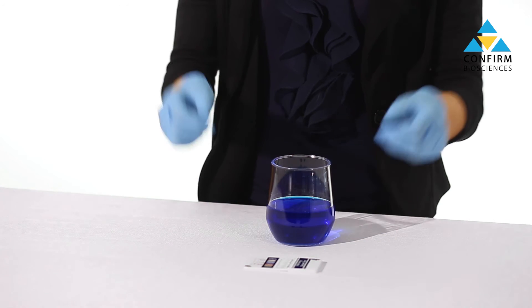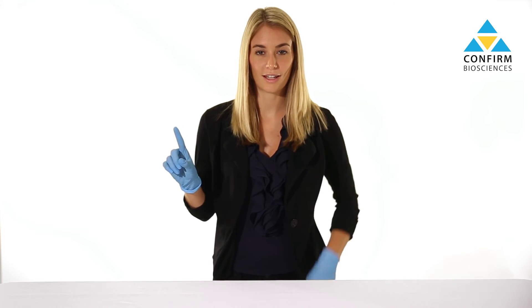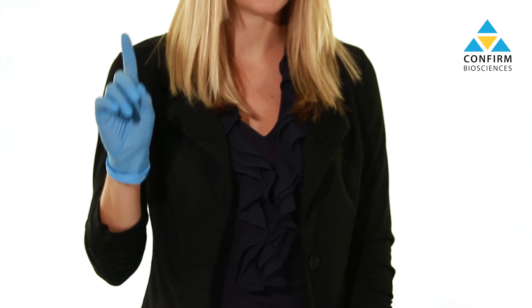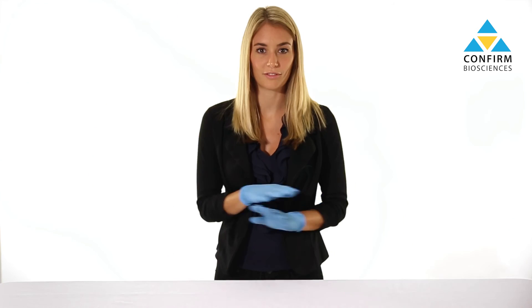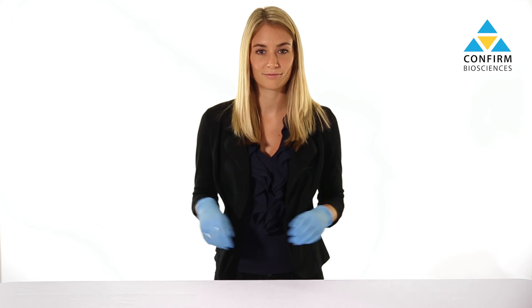Results will be ready for interpretation after five minutes. Negative test results will show two lines, one in the control region and one in the test region. Presumptive positive results will show only one line in the control region, and invalid tests fail to reveal a line in the control region. Please note that even a very faint line is considered a negative reading.